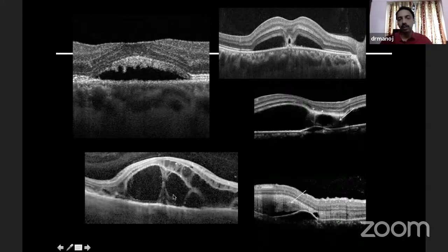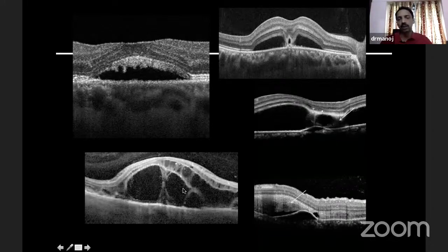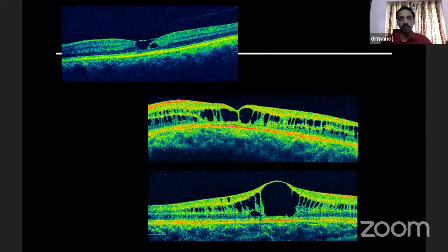Sometimes inside the sub-retinal fluid, you may see septa-like things — when you see such things, you know it's an inflammatory pathology like Vogt-Koyanagi-Harada disease. This is a patient with VKH having this finding. Sometimes the sub-retinal fluid may have blood inside it, and then you have to think of entities like choroidal neovascularization.